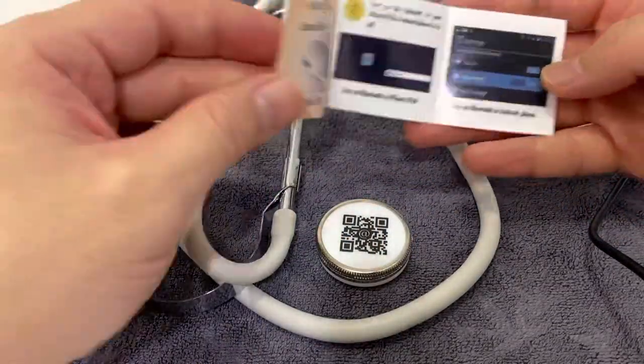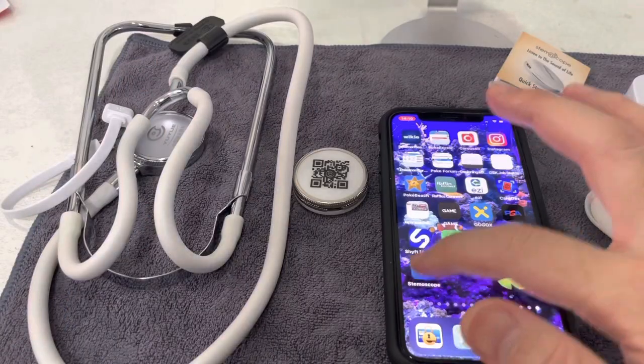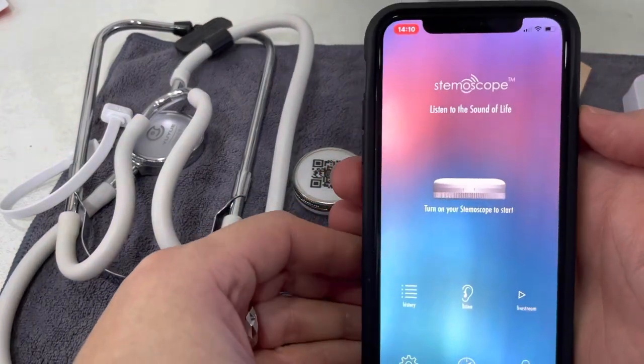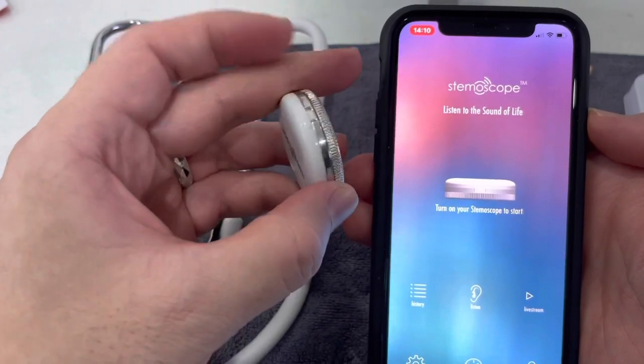There are instructions in English - how to use the device and also how to download the app. You start with the Stemmoscope app, and here it's just asking you to turn on your Stemmoscope. There's a switch on the side.